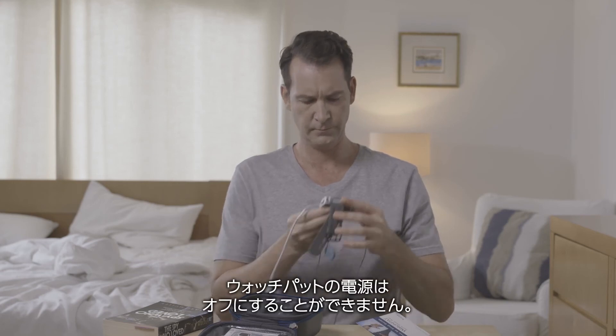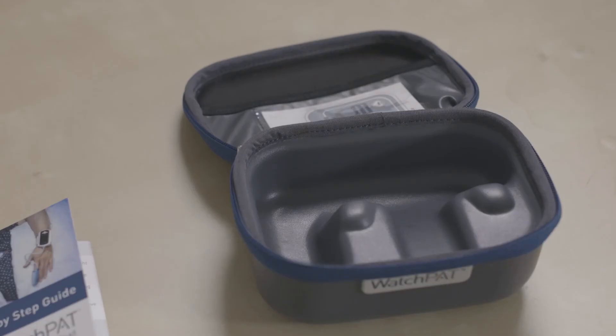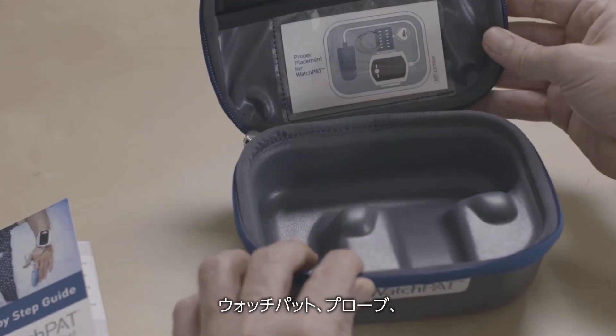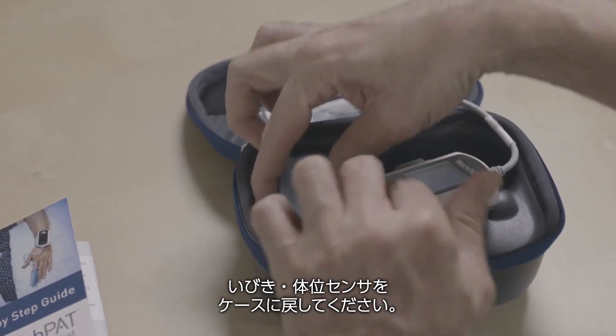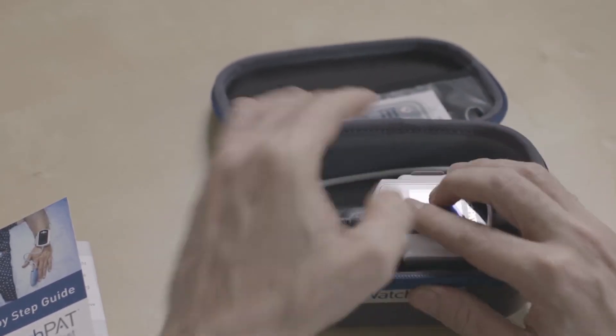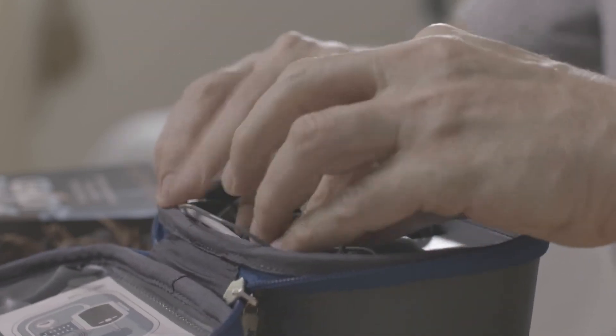Please note: the WatchPAT cannot be turned off. Return the device along with the probe and snoring and body positioning sensor to the case, and finally return the illustrated guide to the case.